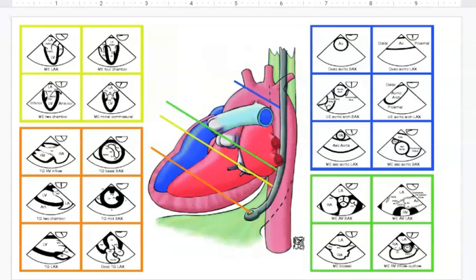But essentially, if you look here, the probe goes down the esophagus and goes behind the heart. And as you can see, we can see the structures pretty well, especially in the atria area. You get really up close to that. The other structures we see, the mitral valve, we get pretty close to that, and we can still get very close to the aortic valve and such to see any type of endocarditis or fibroelastoma or something like that that might be on there.